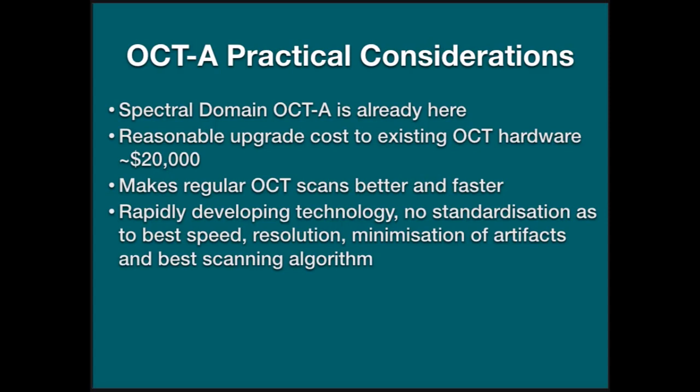And we need to decide, of all the different competing manufacturers, which scanning algorithm is going to end up being the best, which is going to detect the most choroidal neovascular membranes, which is going to detect pathology the most accurately compared to fluorescein angiography, so that hopefully in the future we won't have to do fluorescein angiography any longer. And as I said as well before, there is at the moment very little analytical software and definitely no normative databases for OCT angiography.